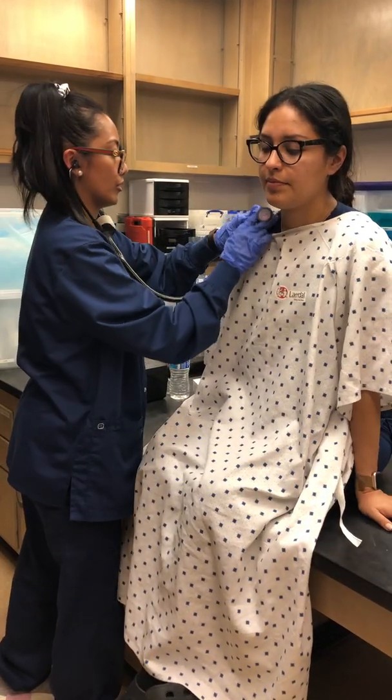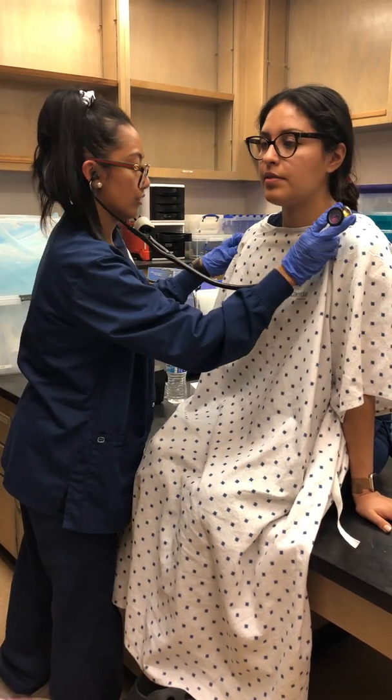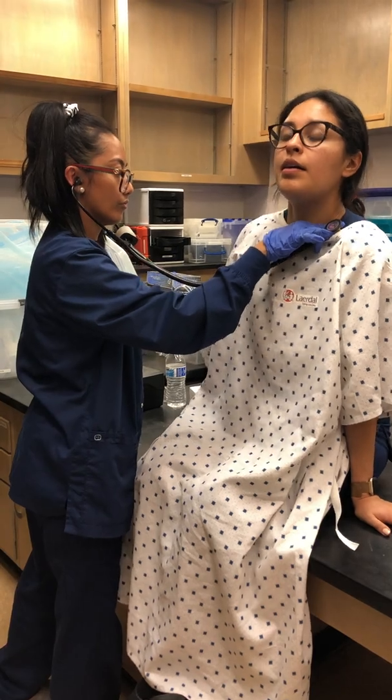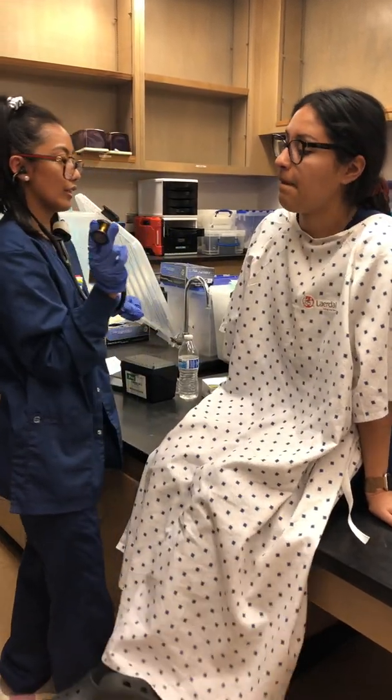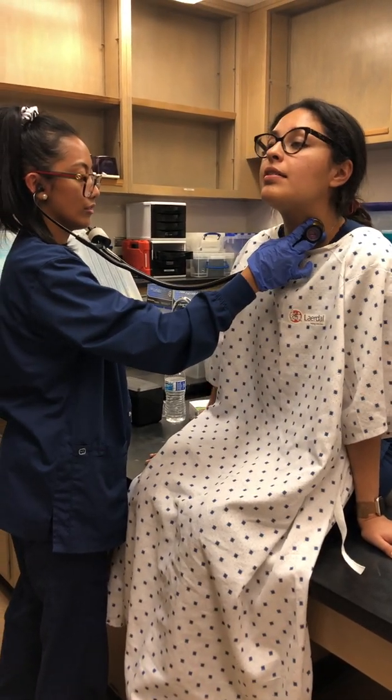Okay. Now one more up here. Go ahead. And then on this side as well. Okay. Still doing okay? Yeah. Okay. One more. Go ahead. Okay.